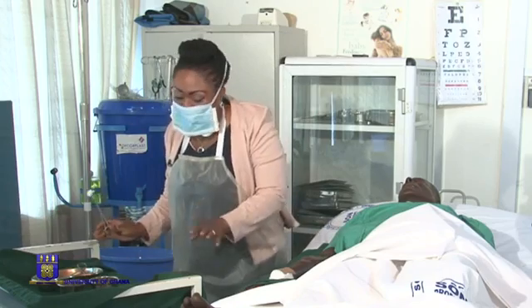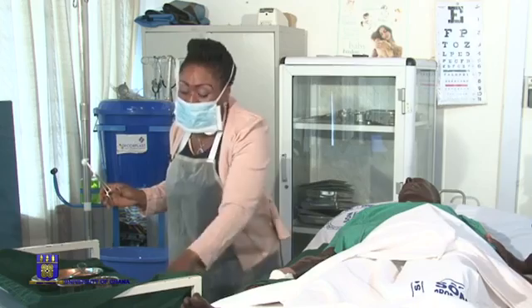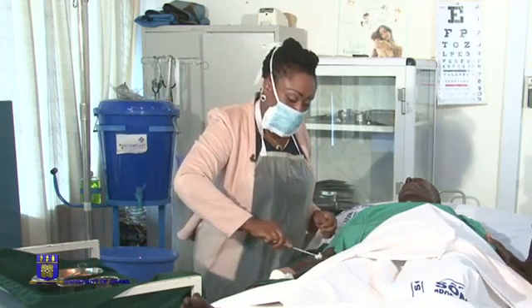All this place is sterile. That is why we can leave our dissecting forceps here. Because we've started using it, we don't want to go back to the sterile ones.